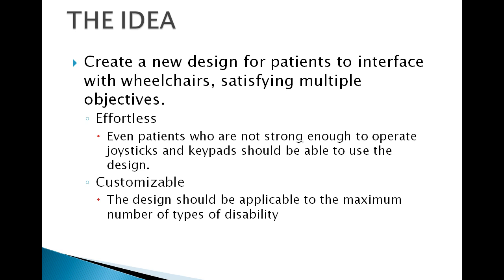The idea behind the project. So my idea is to create a new design for patients to interface with wheelchairs which satisfy multiple requirements, that is objectives. So I'm going to list the objectives that I kept in mind while doing this project here. So the first objective is for it to be effortless. So I want the interfacing method to use zero force for interaction, so that even patients who are unable to operate joysticks and keypads should have no problem using this method.